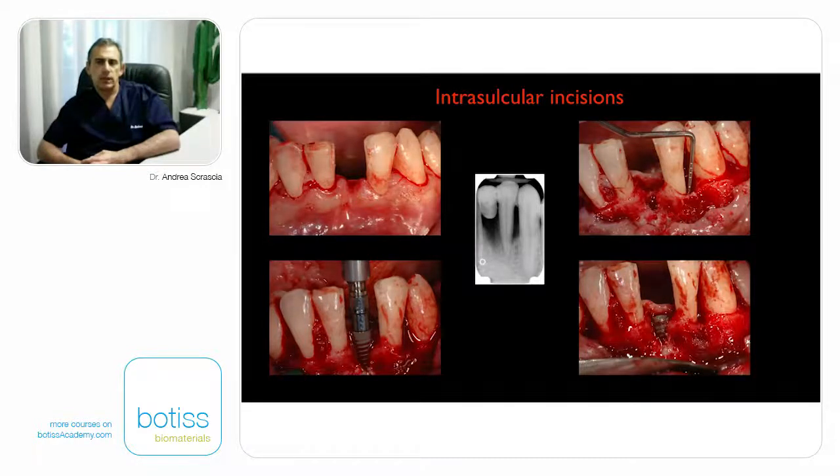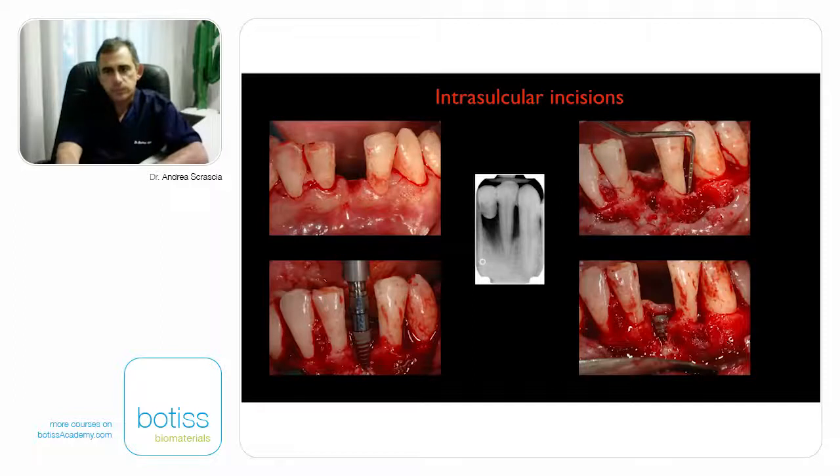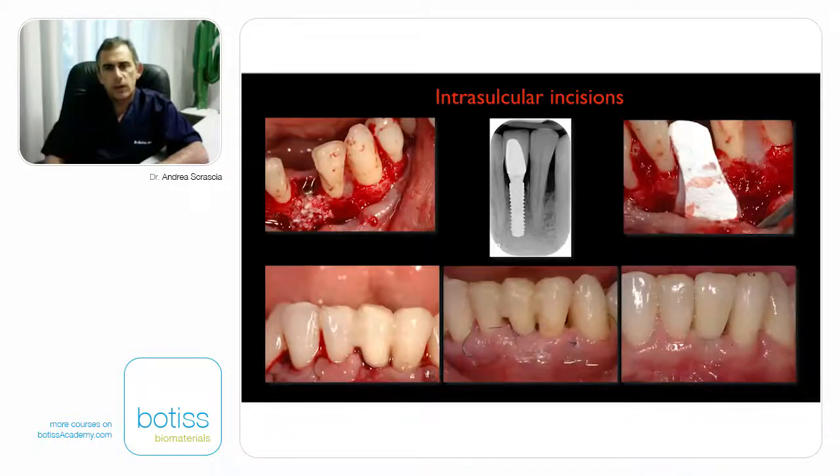Once the patient compliance was in place, we could proceed inserting the implant in area 3.1, alongside a regenerative technique with Endobon for the intrabony defect at the distal wall of 3.2. So we can observe through X-ray the bone amount obtained and the filling of the bony defect.